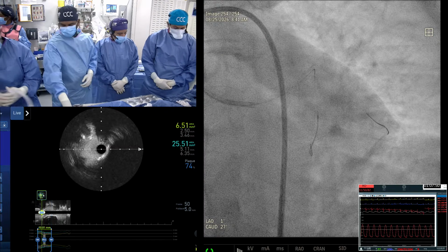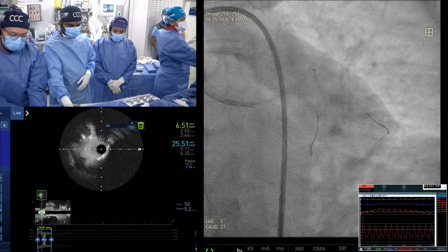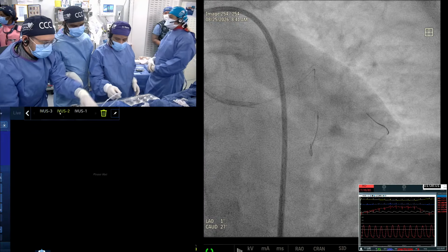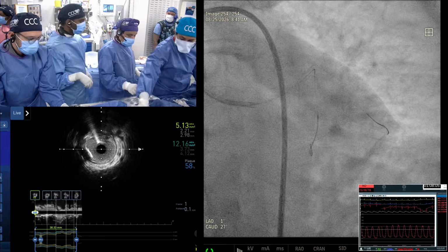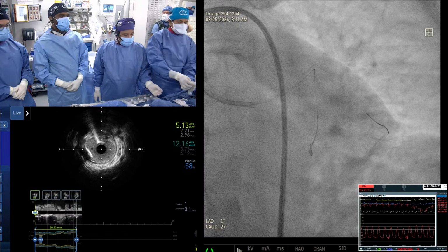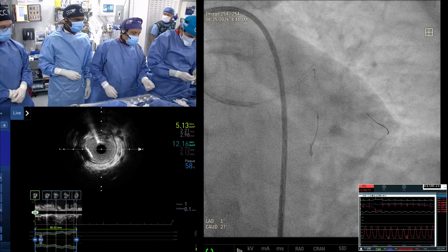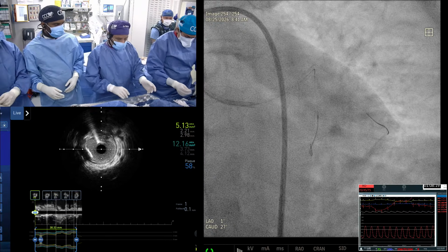What's the plan now? We are going to stent from left main to LAD. Good. So we are using a 3.5 by 33. And let us see, my eyes are telling me 33. Let's see what the imager is telling us. Because the initial plan was from the septal, but now we go more distally, so we don't have that distal image. So now it depends on the eyes. Even Kiski is telling us to use your eyes. I mean, we don't have an IVUS image. 408 ready?